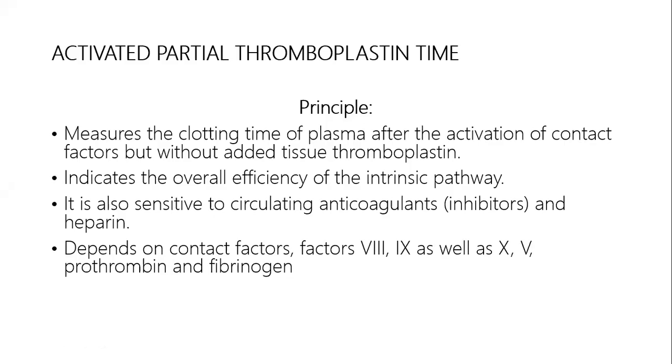Now let's move on to the APTT, or the activated partial thromboplastin time. So the principle of APTT is as follows. APTT measures the clotting time of plasma after the activation of contact factors, but without added tissue thromboplastin, as compared to your PT.